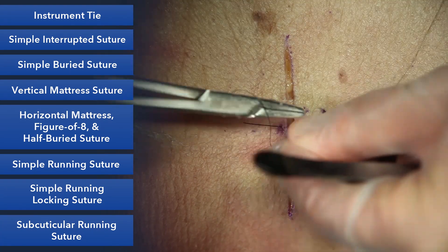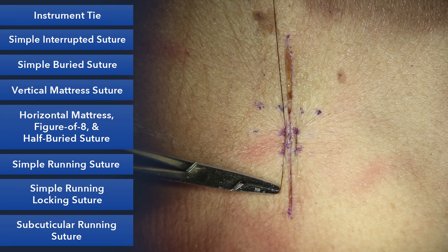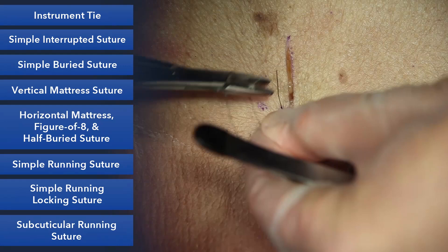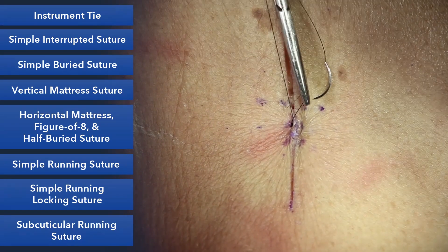The advantage of this is speed compared to doing a simple suture. It doesn't evert as effectively sometimes as a vertical mattress. Here you can see the way I've placed it — it's averting nicely. So that's one example of a horizontal technique.